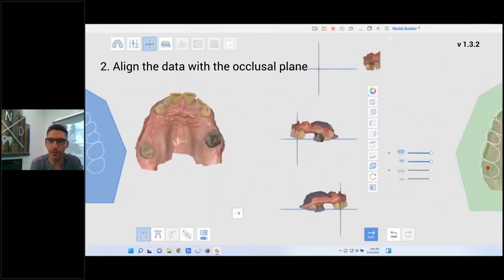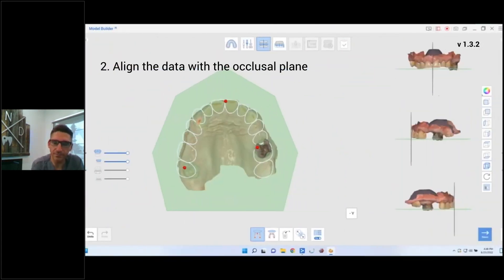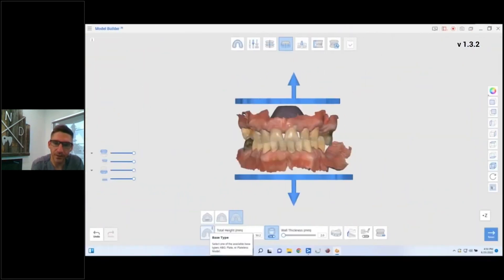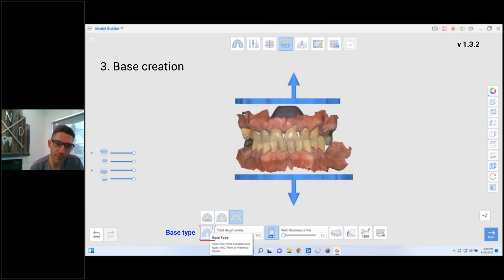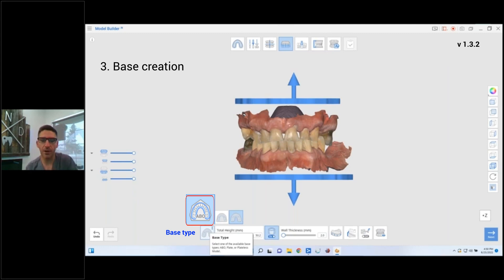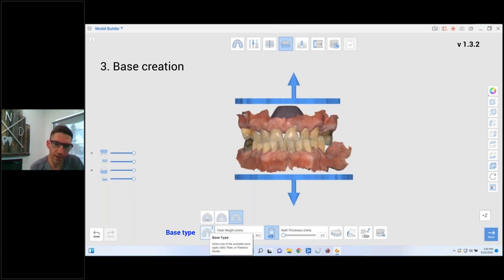Then we're going to set our plane of occlusion, three-point alignment, super simple. Then we're going to basically decide, okay, what do we want this model to look like? So there are a few options on the left there at the bottom for base type. There's like the ortho-style model, and then there's the open, so if it's a lingual it'll leave the whole lingual open, or there's kind of a closed, it'll make like a full complete circle.